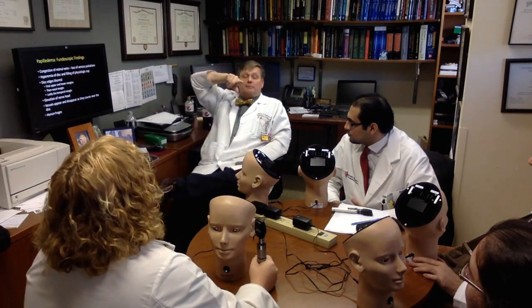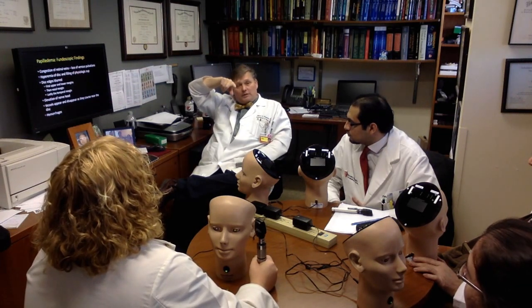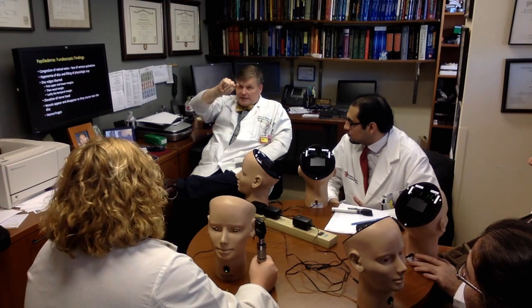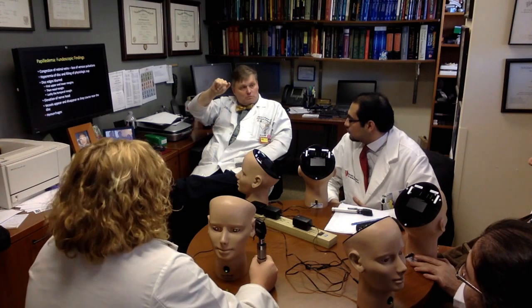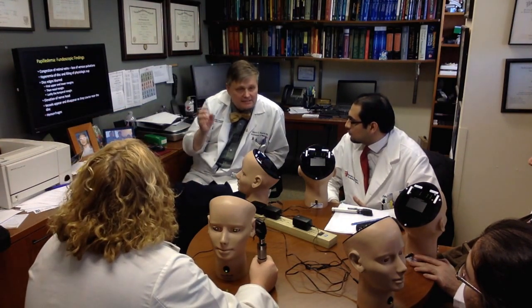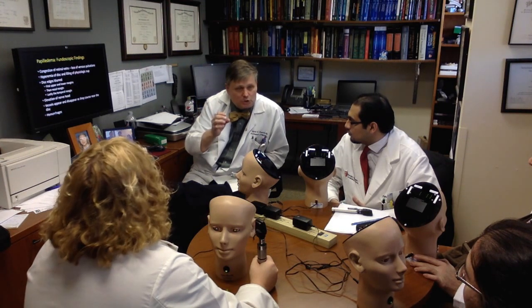You may have even seen some MRI scans already where they do an MRI scan of the globe with papilledema. You can see the optic nerve and the head is actually sticking into the globe. Then what tends to happen is the big vessels, as they approach the disc, get obscured in all the edema.